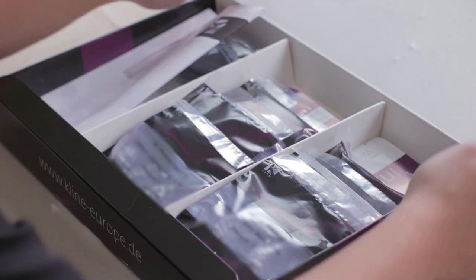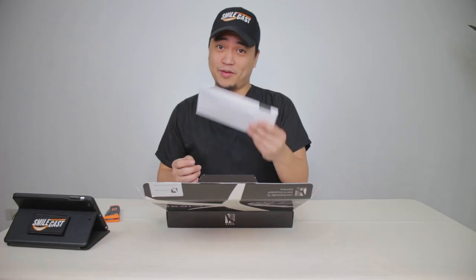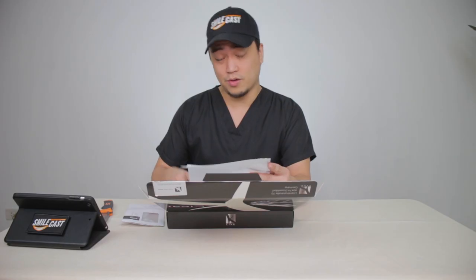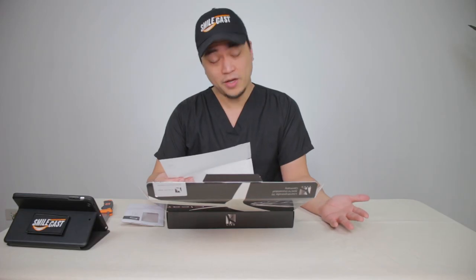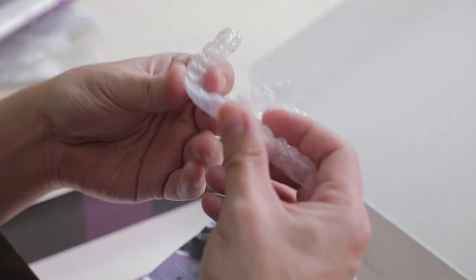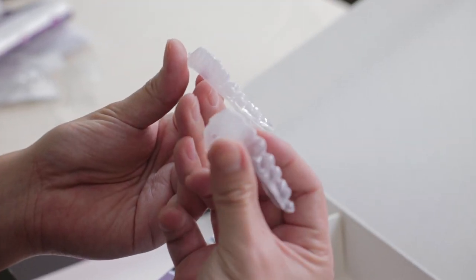Like this one says aligner 1, 2, 3, 4, 5 and so on. We also have a letter in here and this is the diagram of the case, and there are markings on why you need to do the IPR or the interproximal reduction. Treatment notes are listed here as well. Like for this one, they delivered phase 1 — 8 aligners for the upper, 8 aligners for the lower, a template for the upper and a template for the lower.